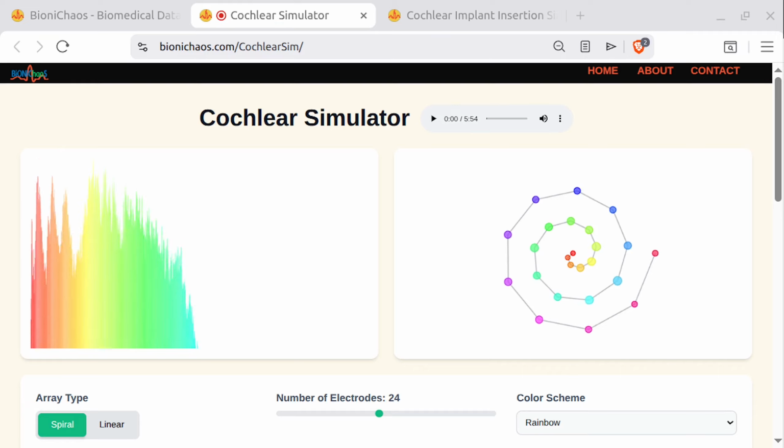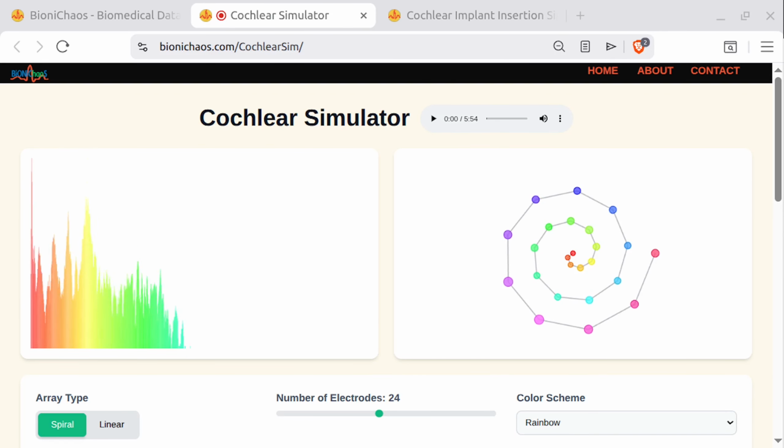Well, they are specialized devices. But if another company develops a vastly superior external processor 5 years down the road, you can't use it. Your internal array only talks to their specific hardware. You are a captive consumer in a way that just doesn't exist anywhere else in medicine. That is the reality of FDA-regulated proprietary bioengineering, unfortunately. The arrays and processors have to be highly specialized to be safe.